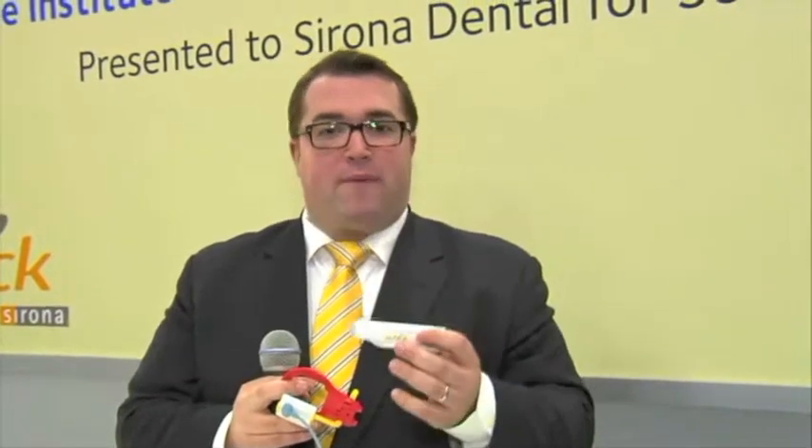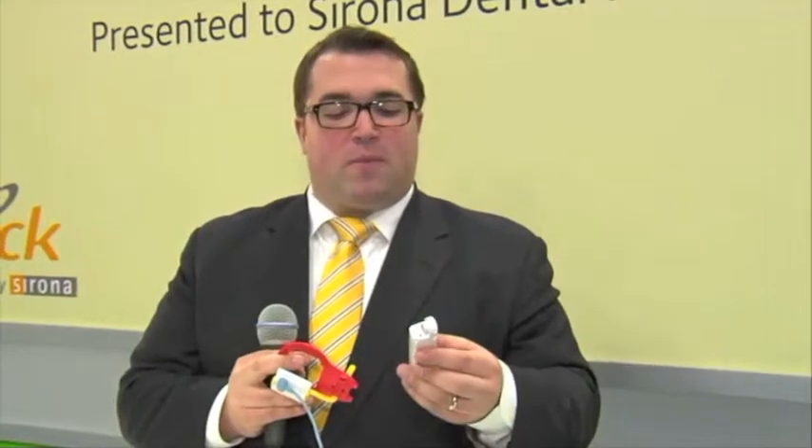We're compatible with most Wi-Fi routers — simple off-the-shelf systems — allowing straightforward integration into most dental offices with no need for custom-designed products. We're really offering a level of flexibility, saying to the doctor: we will suit your needs. Don't change yourself to suit ours.